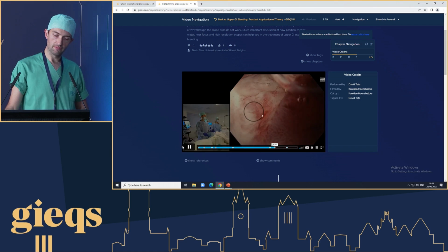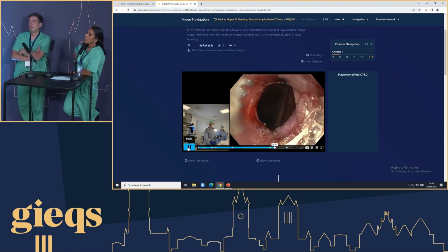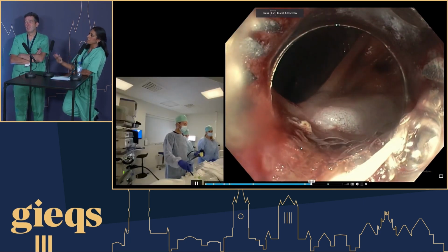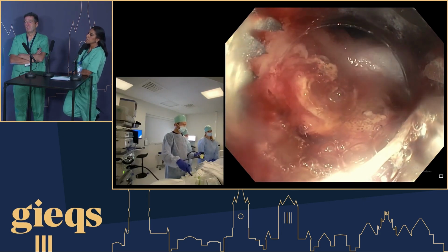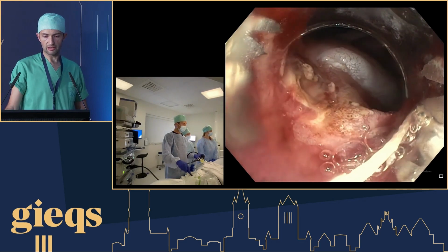Can I just ask a brief question, David, about the report and the instructions for the person looking after this patient after your procedure, and what advice was given to the ward team, plan for second endoscopy, the sort of management ongoing thereafter? Well, let's hold that for 1 second. I think that's a very important question. But you can see it's still bleeding.